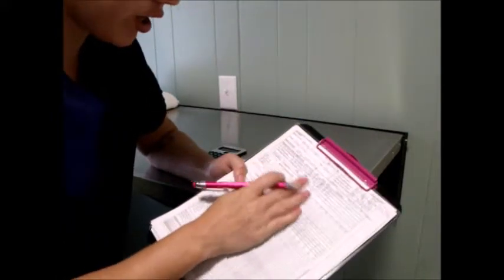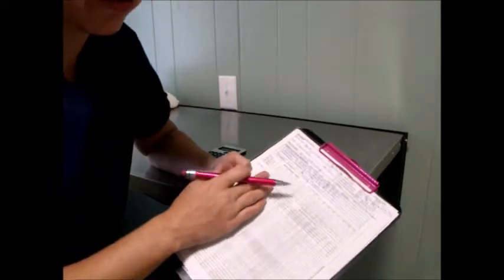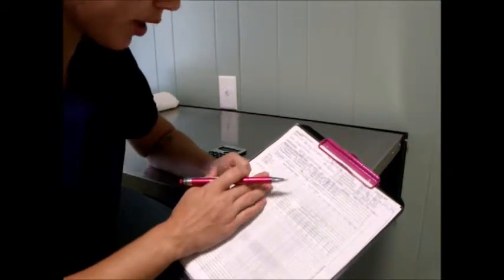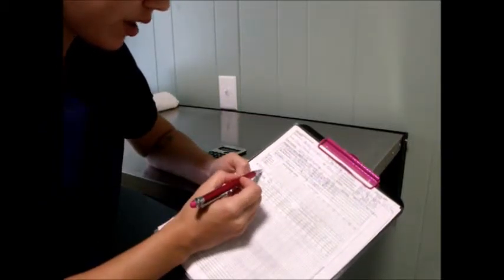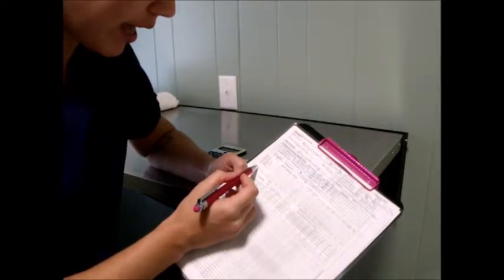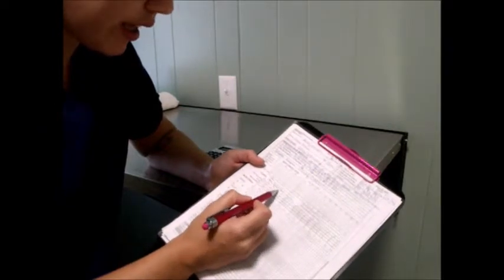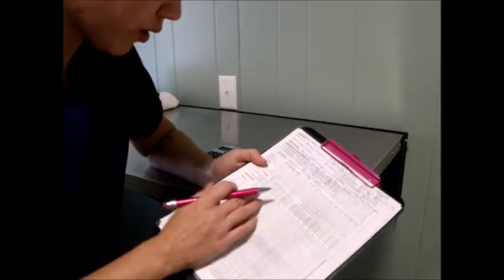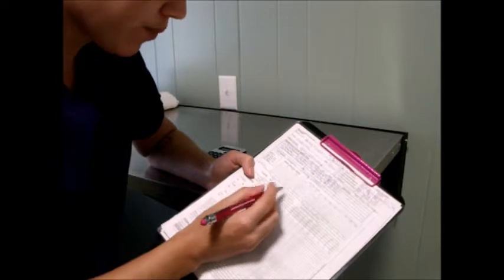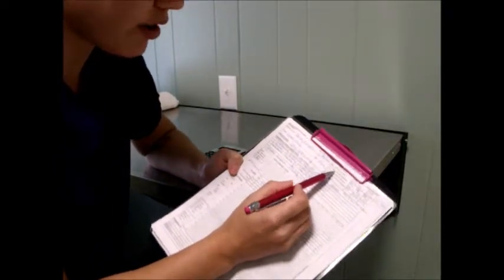And I just want to make sure the rest of this is all filled out. I've got her oxygen flow rate. That rate is usually 50 to 100 mils per kg a minute. We did 75 just to be in the middle, so that comes out to 1.8 liters per minute. I've got her fluid rate calculated, which is the kgs times 5 mils per hour. So that's 120.